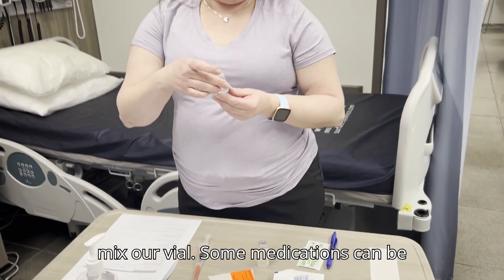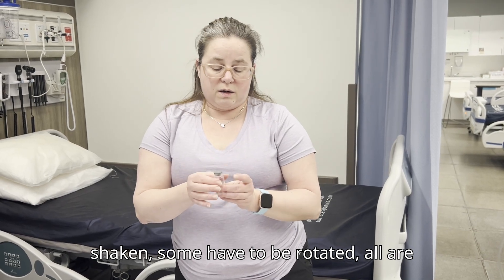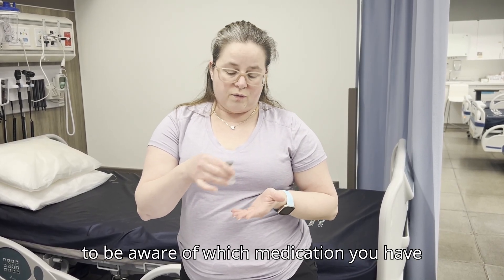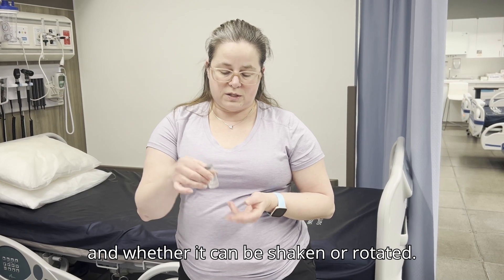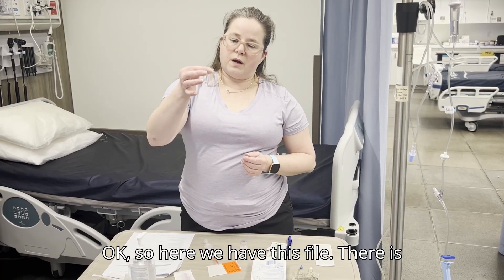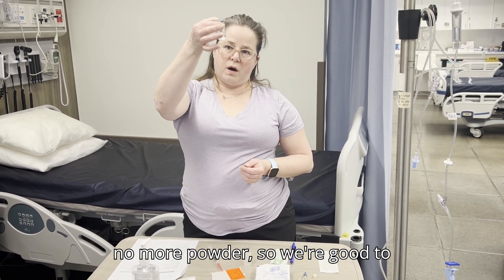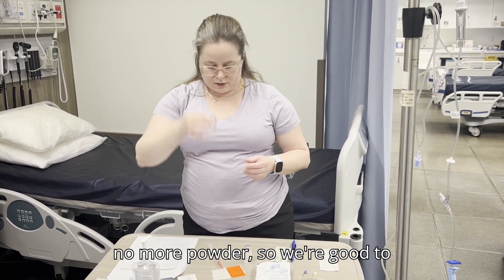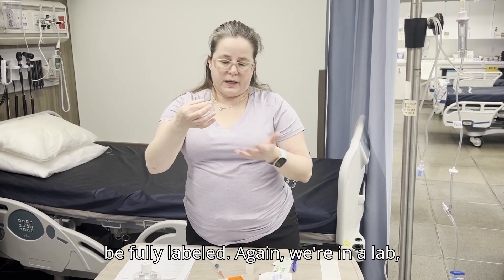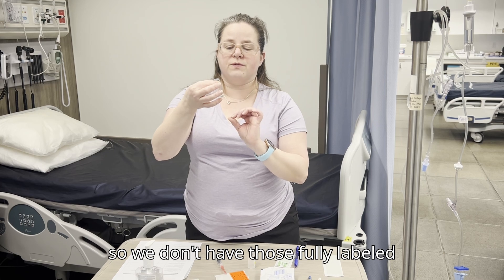We carefully recap the syringe so we can set it down while we mix the vial. Some medications can be shaken; some have to be rotated — they are all different. As the nurse, you have to be aware of which medication you have and whether it can be shaken or rotated. Once there is no more powder visible, we're good to go.